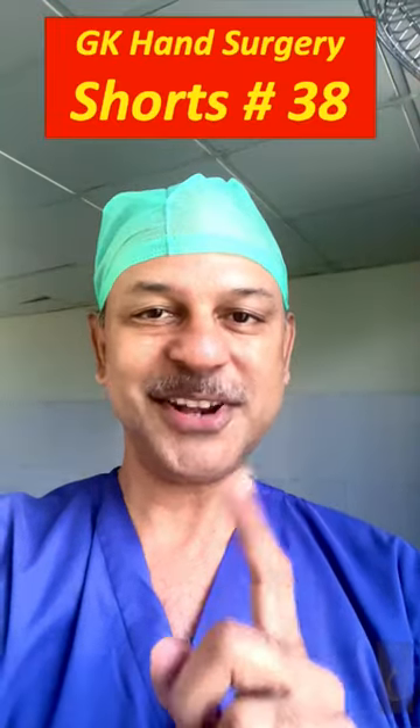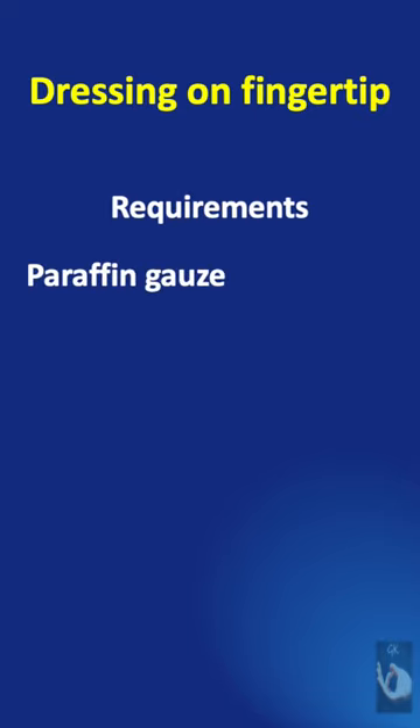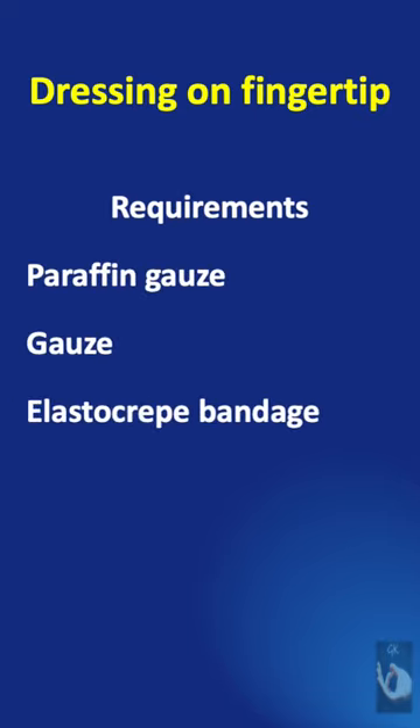Learning hand surgery one point at a time. To do a dressing on a fingertip we need paraffin gauze, a regular gauze, an elastocrepe bandage 1 inch by 6 inches, and a 1 inch micropore plaster.